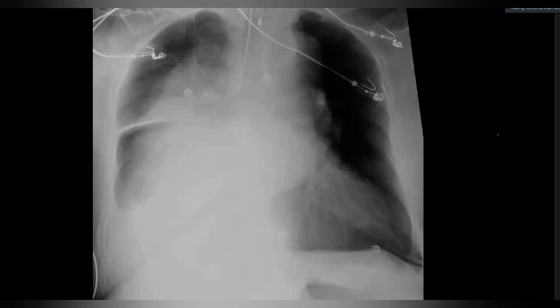Nasty. So I said to him, the endotracheal tube is now in the correct position. He said, yes, forget about that, because that was his film to fail somebody. So don't forget your lines and tubes whenever you look at a chest X-ray.